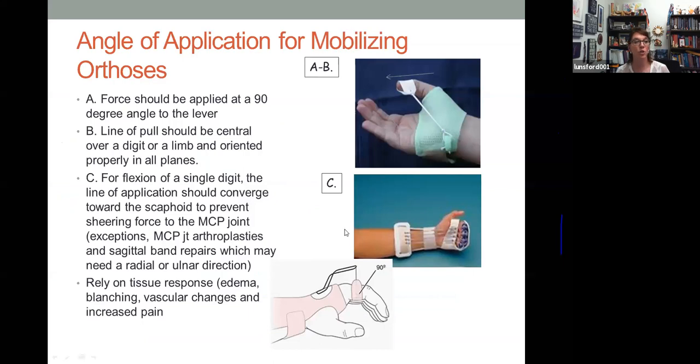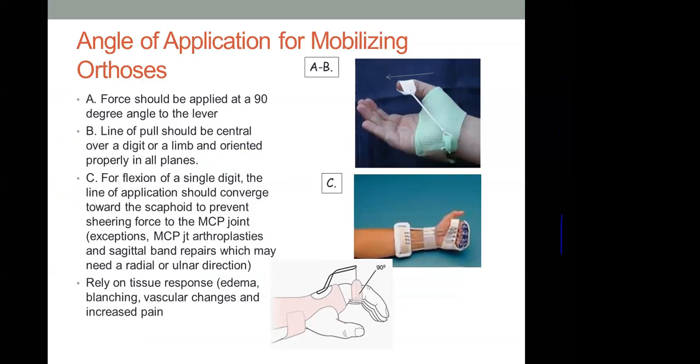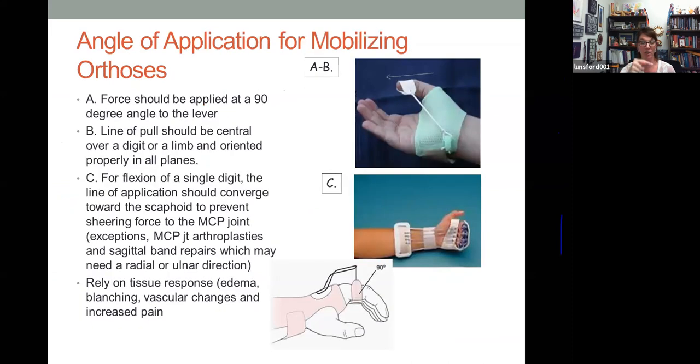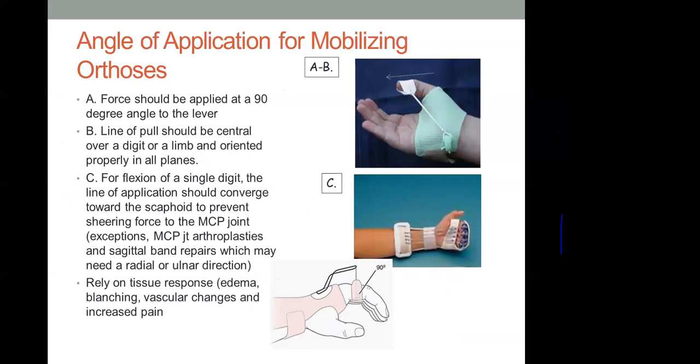So, force being applied. Is that it? The one with the triangles. Ah, so this is your lever system. So having your length two-thirds up, in order to provide the appropriate lever arm across the joint, especially of the wrist. The length, the depth needs to be at the border. I know you like this one, but this next one breaks it down a little bit more as well.